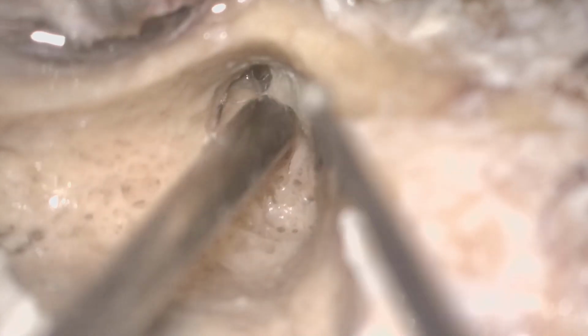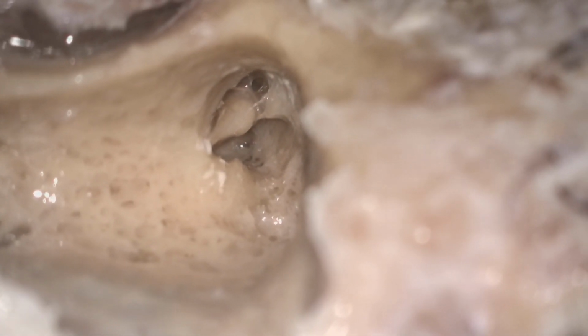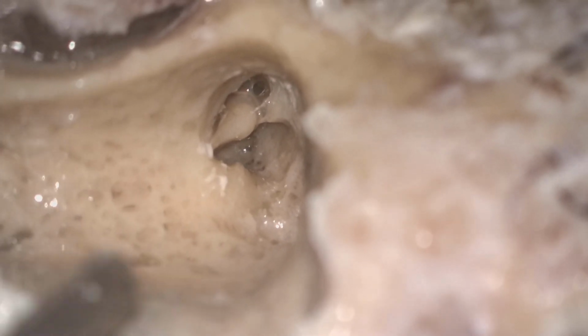In that part you should be very vigilant that your bur should not touch the malleus or the incus. This is a cadaveric temporal bone dissection, so there is no harm, but if your high speed bur touches the ossicular chain, then there will be a high chance of postoperative SN loss or high frequency sensorineural hearing loss in that patient.